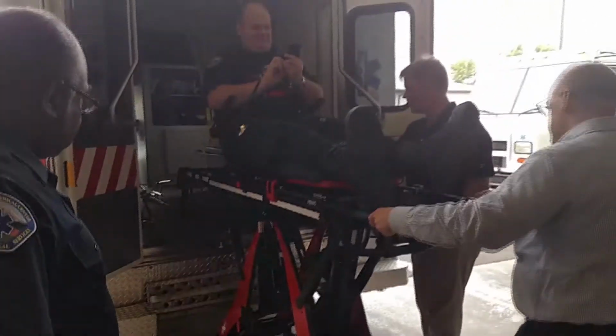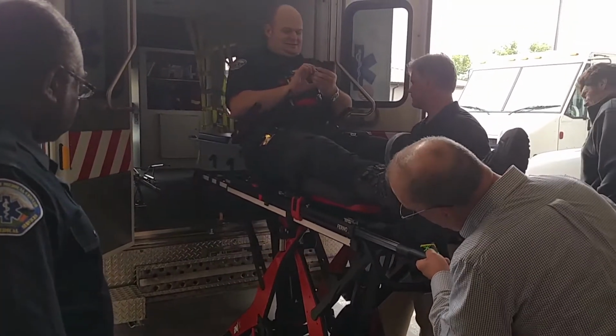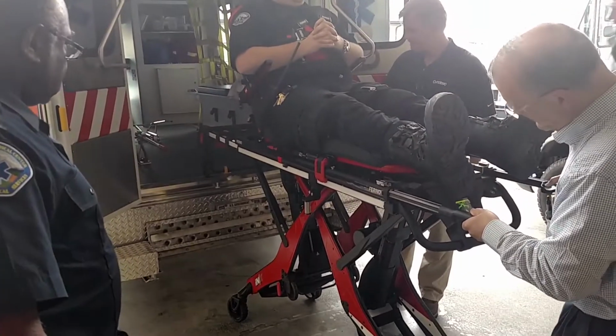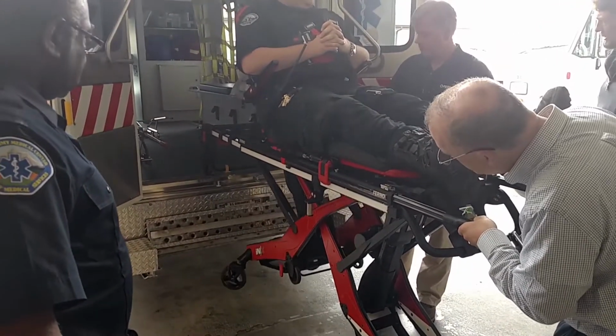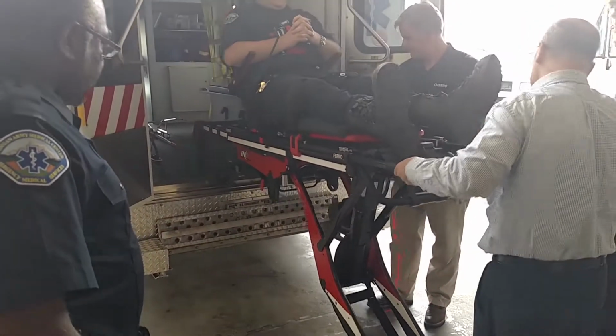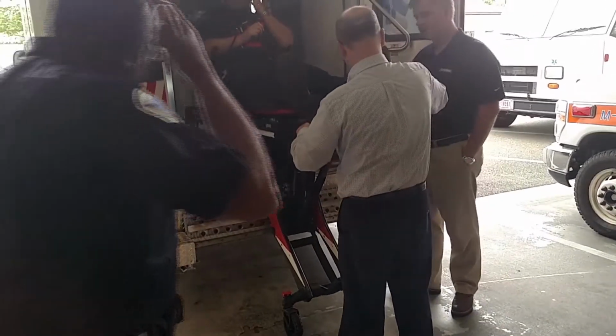So as soon as you get past that, you can stop. Come out. Okay, hook's caught. Now press minus. You just gotta move it over somewhere. When you're putting it in, you just gotta make sure it's lifted up. Yeah. So did it automatically kick up? There you go. Yep.